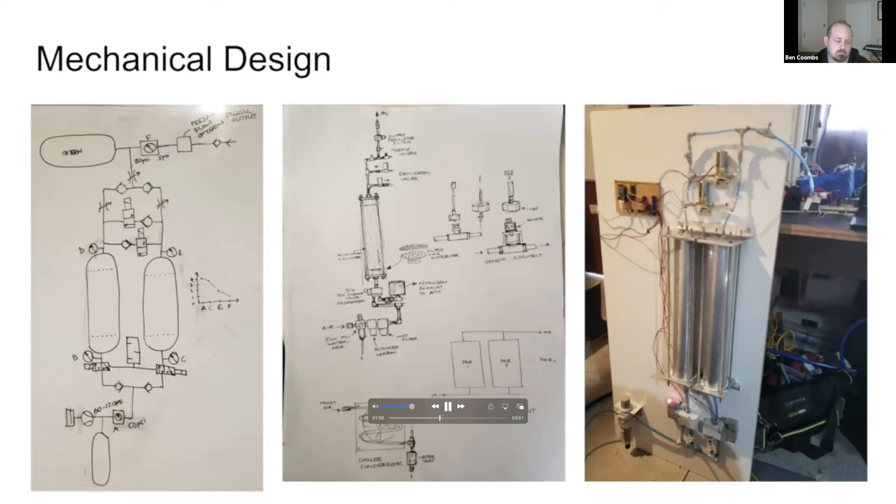The nitrogen is then purged to atmosphere. The two tanks alternate between absorbing and purging in a continuous cycle where the pressure swings between zero and about 30 psi. This pulse output is buffered in a small receiver, which contains about 95% oxygen and 5% argon. This is exhausted at the desired rate for oxygen therapy.